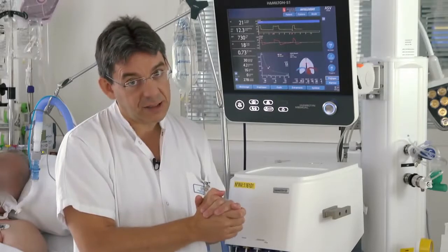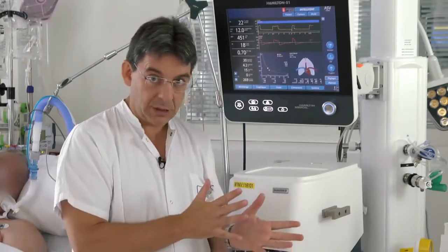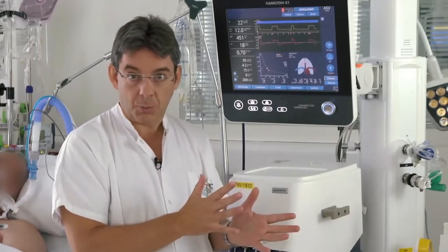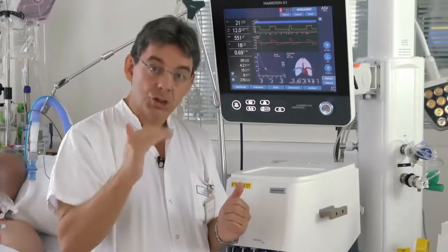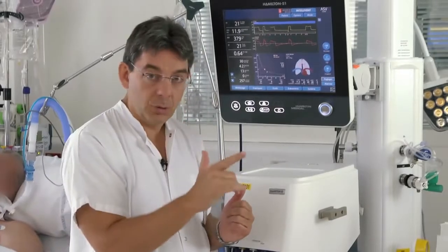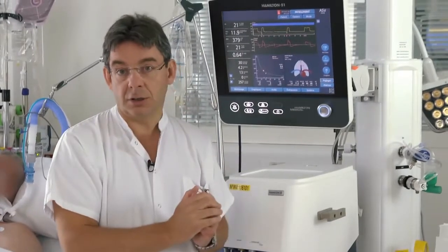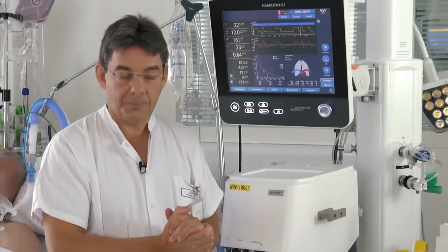If the patient is active, it will switch automatically to a pressure support mode with an automatic adjustment of pressure support to reach the target tidal volume. In this case, the respiratory rate is controlled by the patient and no more by the ventilator.